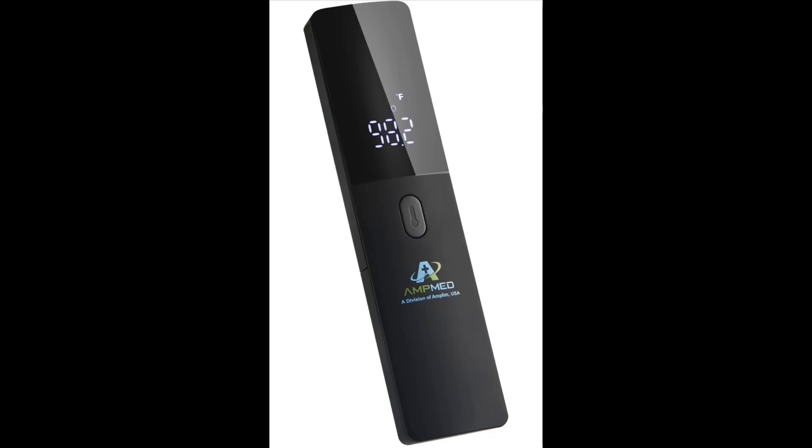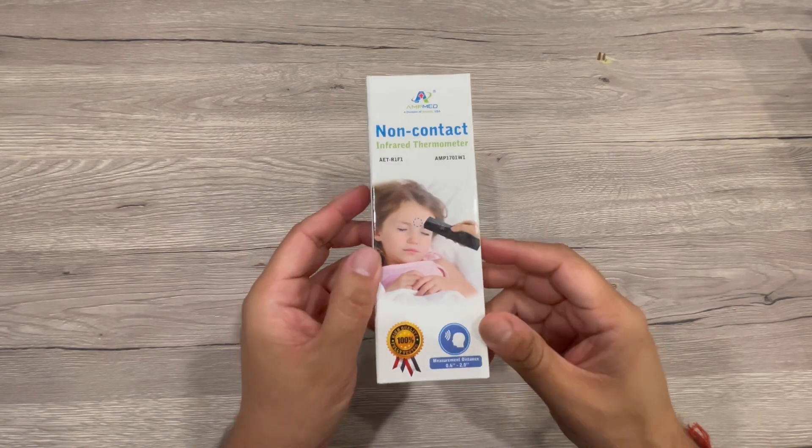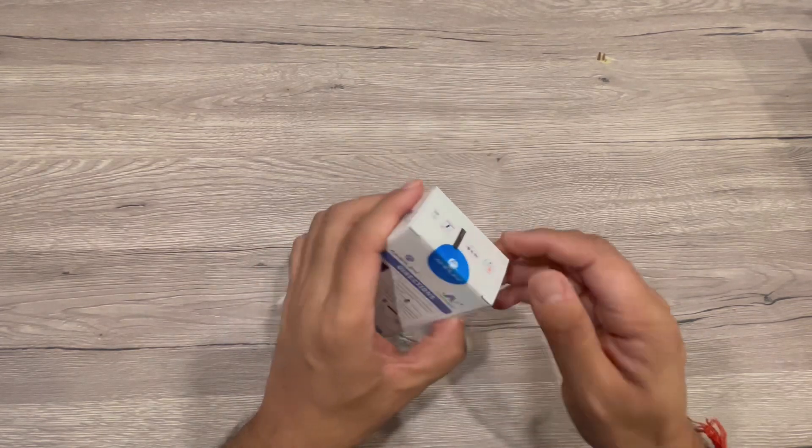We received this Amplim no-touch forehead thermometer for adults and kids to test and try. This is a non-contact digital baby thermometer for anyone to use.